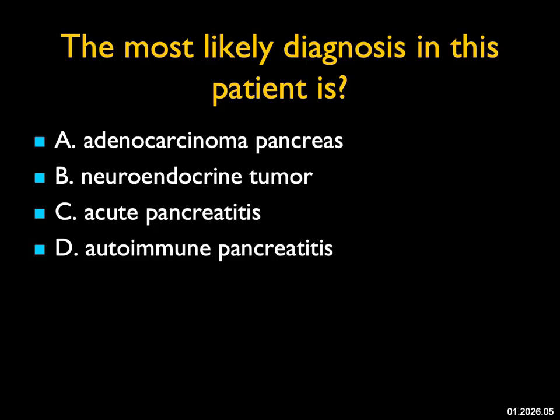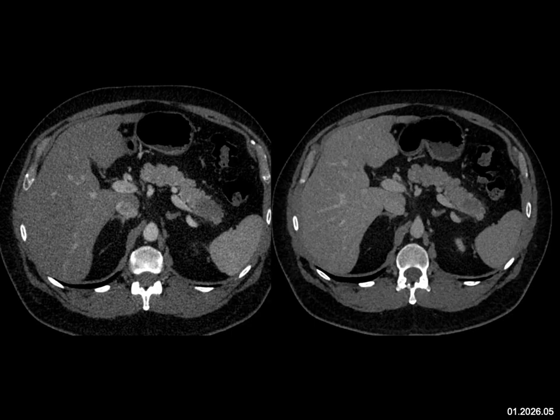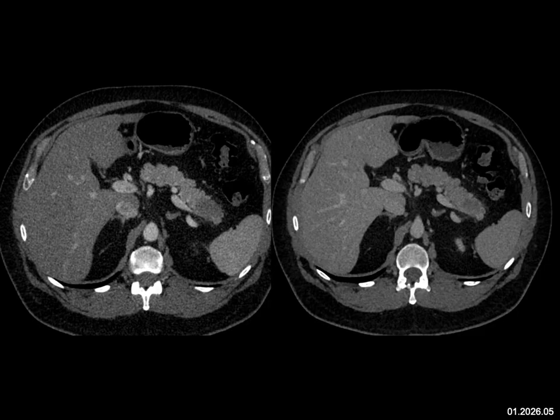The most likely diagnosis in this patient: there's a mass in the tail of the pancreas that is hypovascular. I do not see a dilated pancreatic duct, but this is a classic appearance for adenocarcinoma of the pancreas. Low-density lesions could suggest focal pancreatitis, but there's no stranding around the gland. It doesn't look like autoimmune pancreatitis. It's not a neuroendocrine tumor, which is typically hypervascular. The absence of stranding tends to rule out both autoimmune and classic pancreatitis. This is a classic example of pancreatic adenocarcinoma.